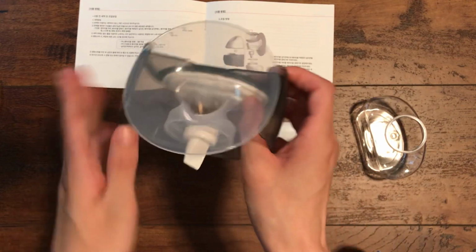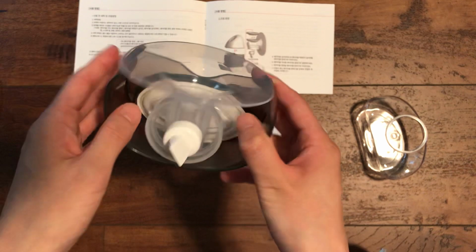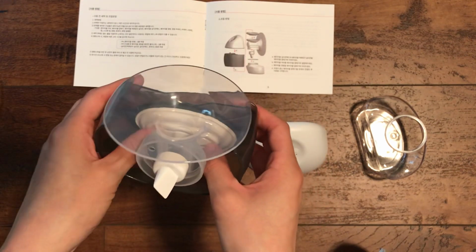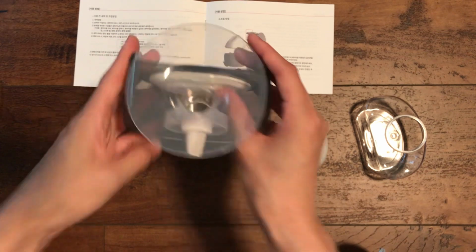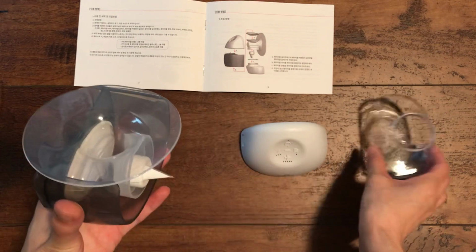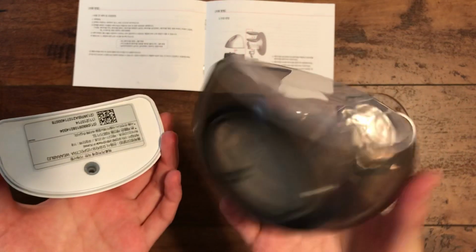So after putting the silicone parts into the phalange, I would just go ahead and attach this to the brown unit. I don't know what else to call it, the cover, I guess. And not having the bottle here allows you to push it in farther. So you can push in the phalange part quite flush. So that's pretty secure. And then the instruction tells you to put in the bottle, but I found that it's actually easier to do the unit first, because it's a little bit tricky to put the main pump to this unit.